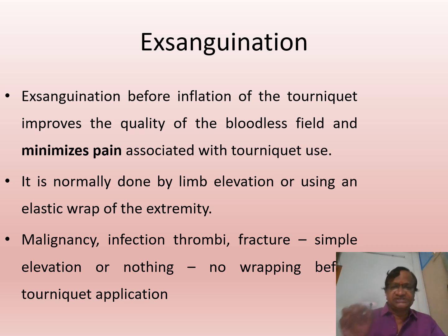Exsanguination before inflation improves the quality of the bloodless field and minimizes pain. Now you do what you do here. After some time, you remove the blood from here. After some time, you establish a tourniquet. So this is what is called exsanguination.